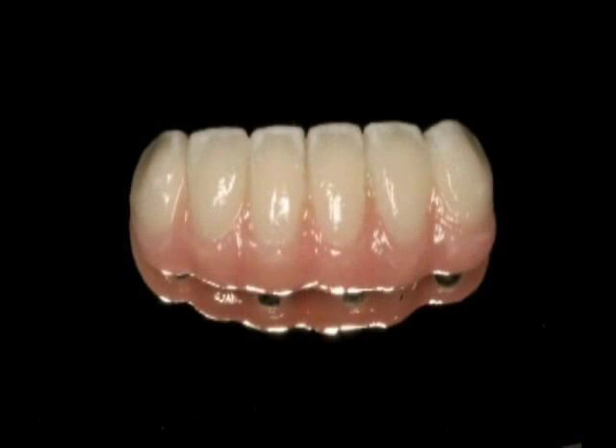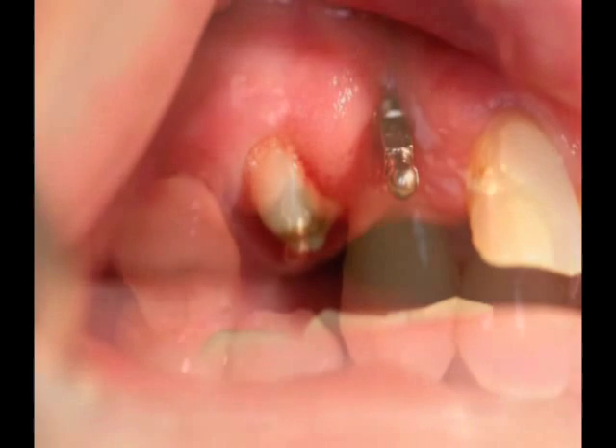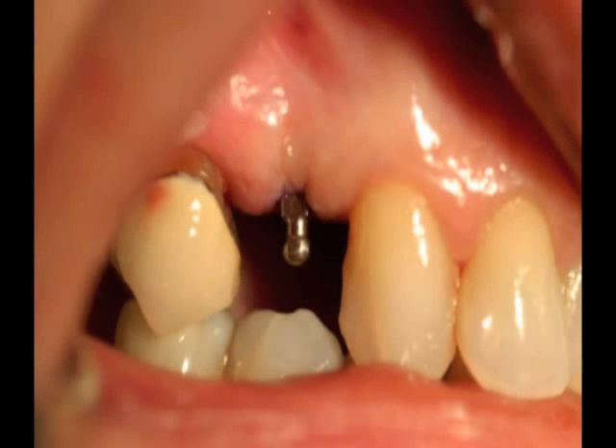The procedure is also quick. The patient's existing denture can often be utilized and the total treatment time is about an hour. Finally, cost is usually a factor for our patients and this procedure is a fraction of the cost of the root form implant options, due to both the cost of the implants and the associated materials as well as the total treatment time.